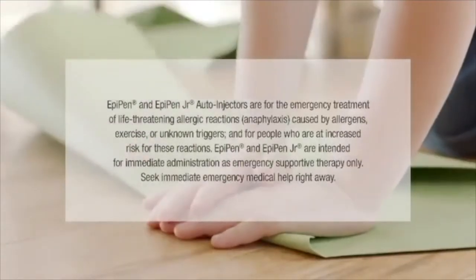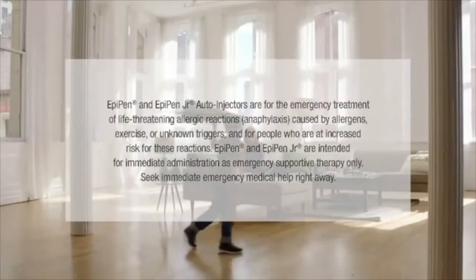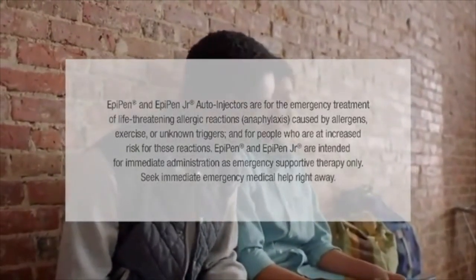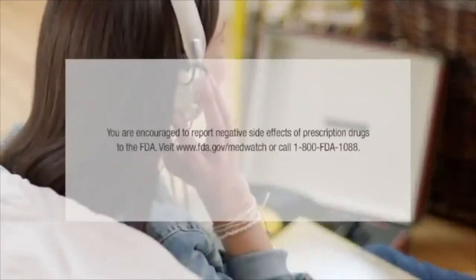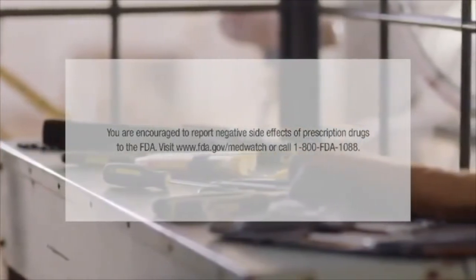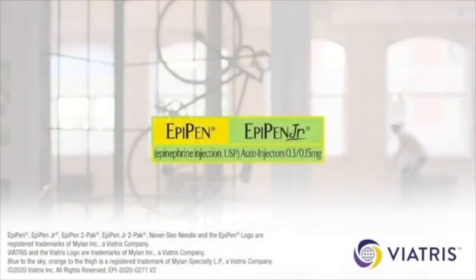EpiPen and EpiPen Junior auto-injectors are for the emergency treatment of life-threatening allergic reactions — anaphylaxis — caused by allergens, exercise, or unknown triggers, and for people at increased risk for these reactions. They are intended for immediate administration as emergency supportive therapy only. Seek immediate emergency medical help right away. You are encouraged to report negative side effects of prescription drugs to the FDA at www.fda.gov/MedWatch or call 1-800-FDA-1088. Talk to your healthcare professional to see if EpiPen or EpiPen Junior is right for you.